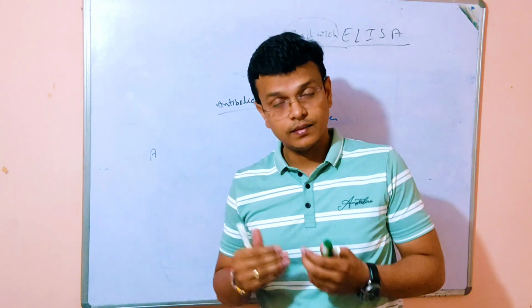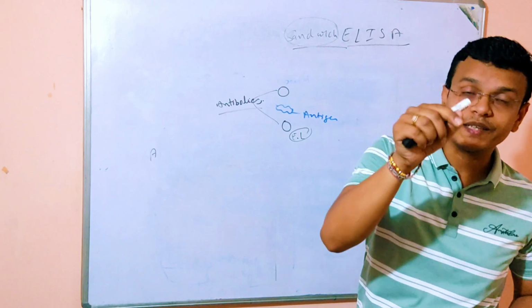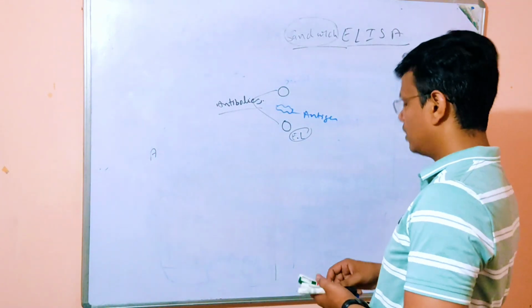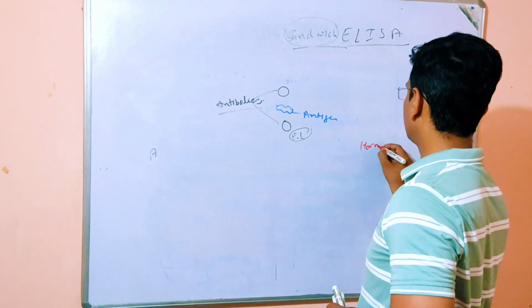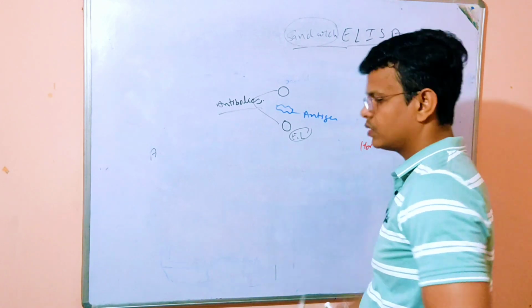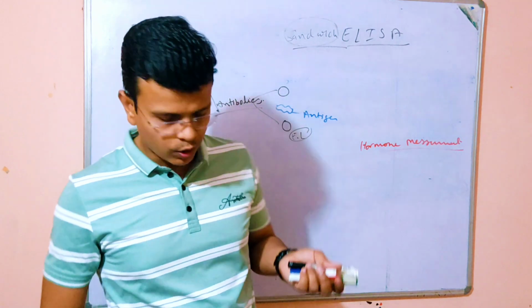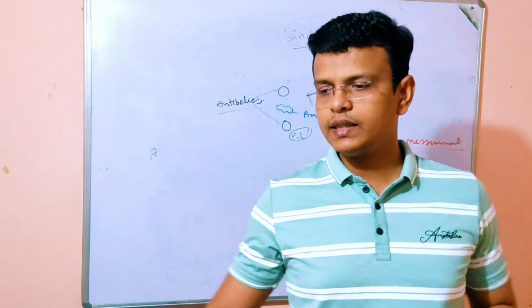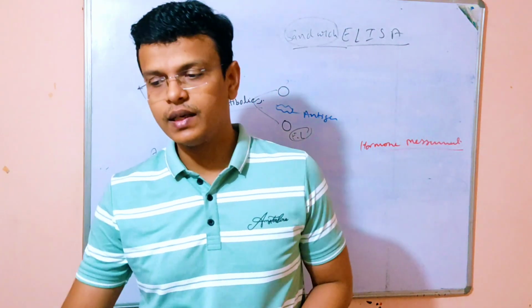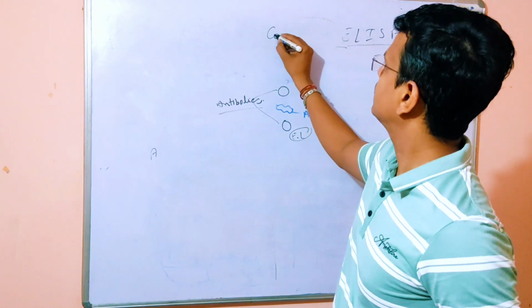Why is it important? Because it is highly sensitive and highly specific. This is the benefit, and it is most commonly used in hormone measurement. Also used in cytokine detection and biomarker analysis. So it is important. Now the next and last is competitive ELISA.